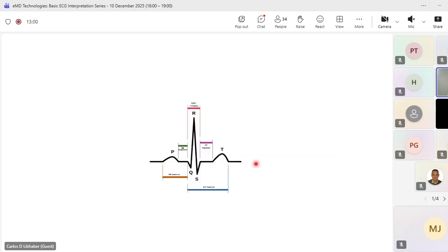Now, you remember this is the PQRST: the P wave, the QRS complex, and the T, the recovering of the heart. Remember the P, we were saying it's the car coming from Pretoria, crossing the bridge with or without delay.